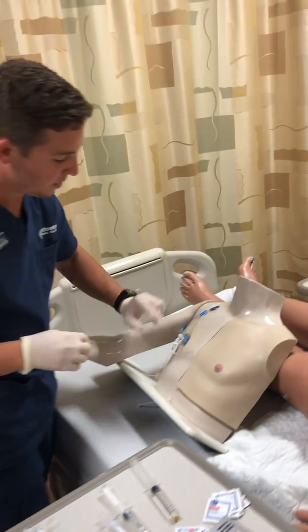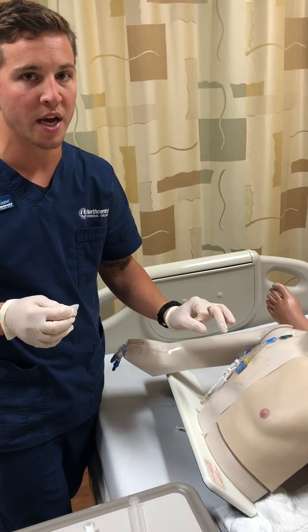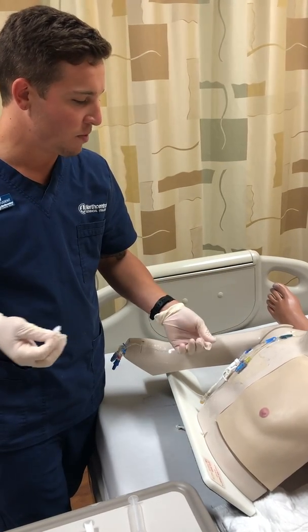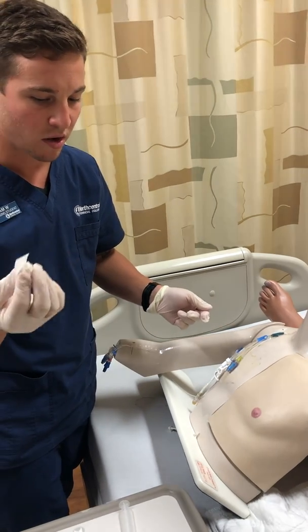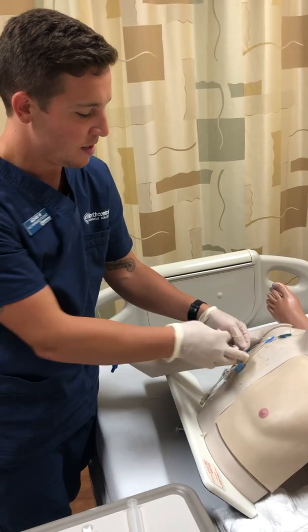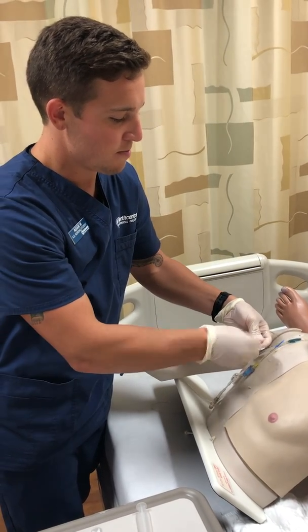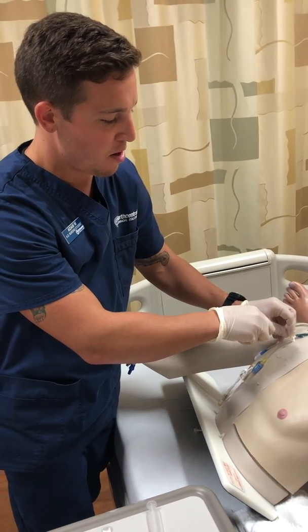Okay, so here, sometimes facilities will use what's called a CHG impregnated cap. You would obviously want to remove that. At the end, you'll want to replace it, but since we don't, we're going to use alcohol swabs. That's what our facility wants, 15 to 30 seconds. So here we're going to clean. Okay, we're going to unclamp.